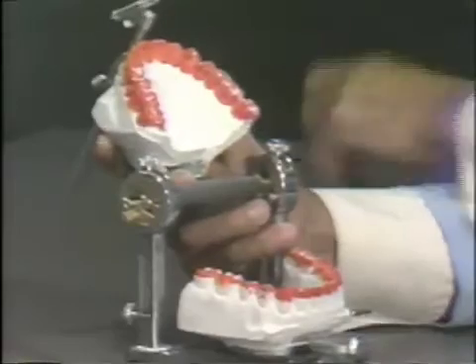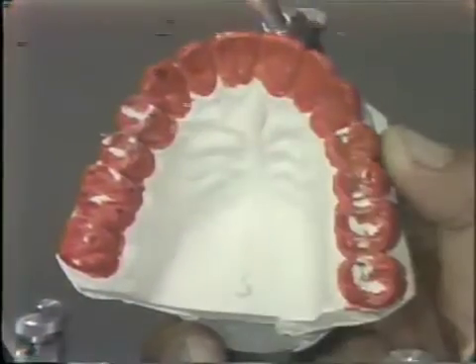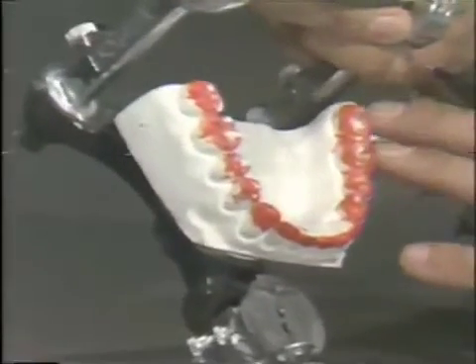If we turn this slightly around, staying on that same tooth, we'll remember that over here we have a contact on this part of the lingual cusp — and this is a centric contact — so the small alteration that occurred here on the buccal will not affect this lingual cusp, and it will still maintain a stable centric contact. We also have a stable centric contact here on these lingual cusps. On the opposing side, these lingual cusps are also making stable centric contacts. Going down to check the mandible again, on this side we still have the remnants of the initial balancing contacts here, but nothing was removed.